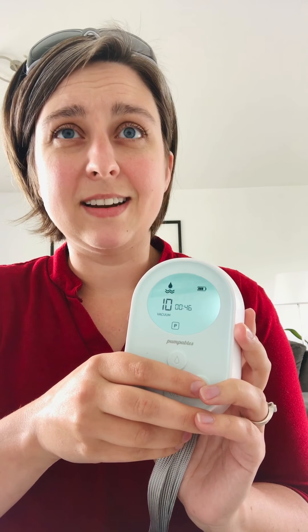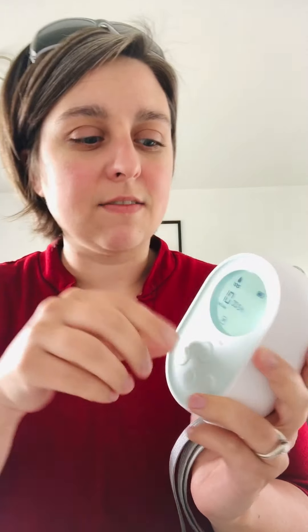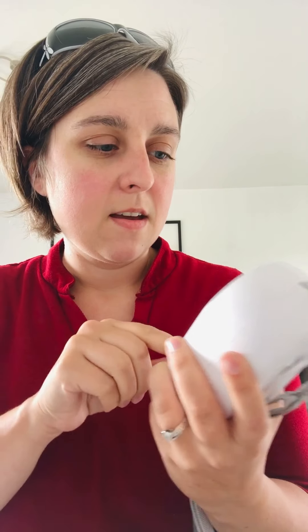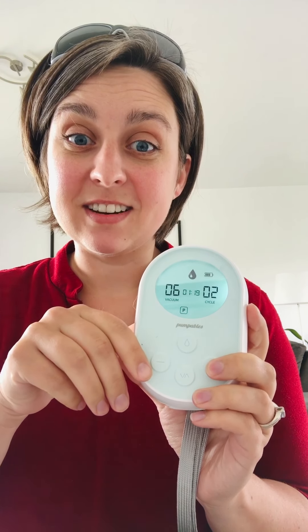The Pumpables does have a nice low end suction, and it goes up to 10 levels — about 260 was the max I could get. The Baby Buddha definitely has stronger suction on the high end if that's something you need. It has a stimulation mode with 10 vacuum levels, which gives you a lot of options, and also 10 vacuum levels on expression mode, plus three different cycle settings you can do.